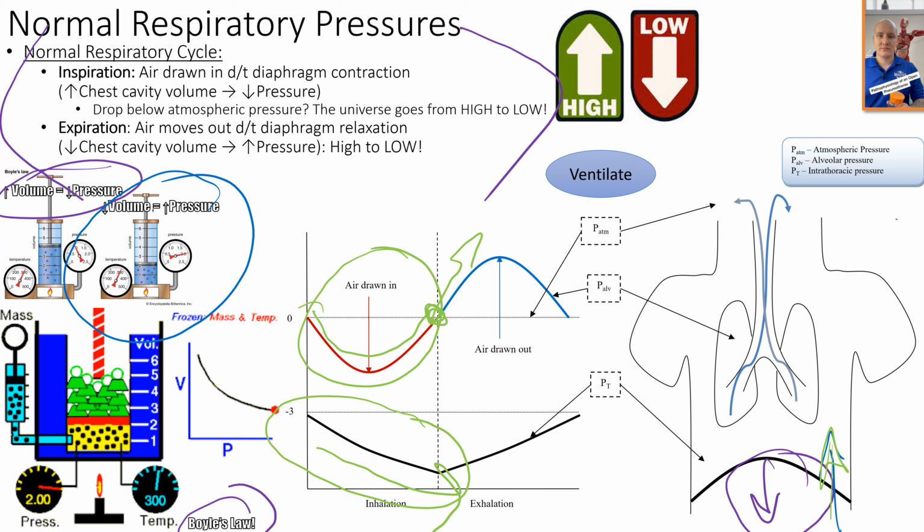So we look for this on the ventilator. We look for this little drop in pressure, right? And the ventilator looks for it too, and the BiPAP machine looks for it too. So they're taking a breath. They're going to do positive pressure at that point, right? So they're able to support the patient and work with the patient whenever they take a breath, right? And the RT could go in there and change that trigger. They can make it less sensitive or more sensitive. Okay, so that's the idea behind normal ventilation.